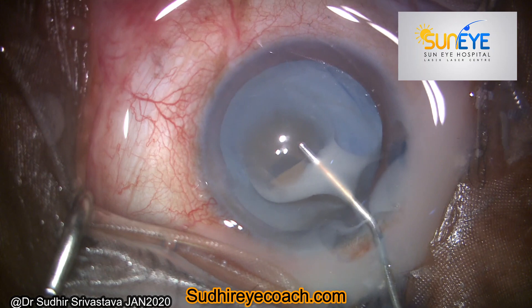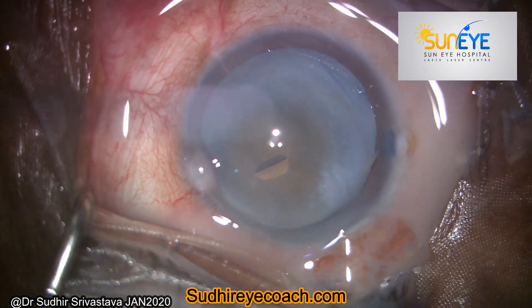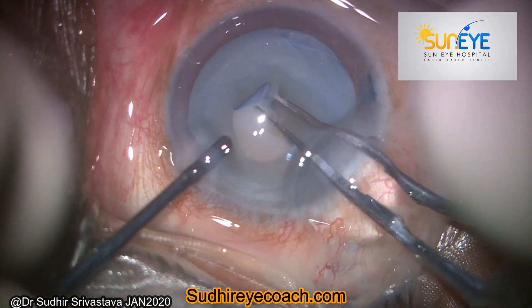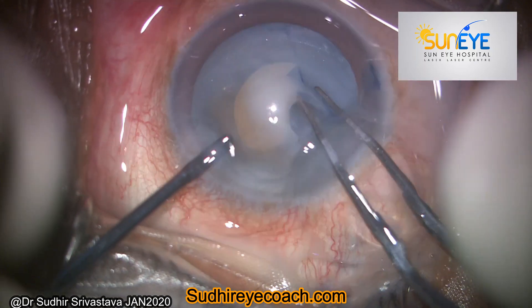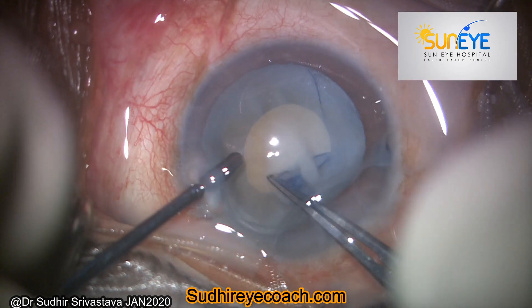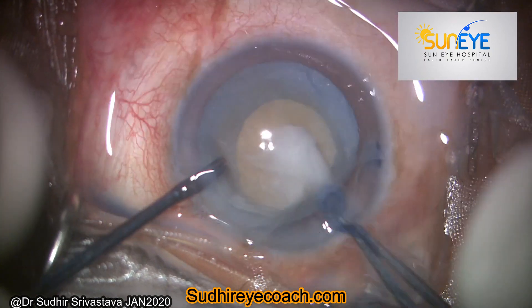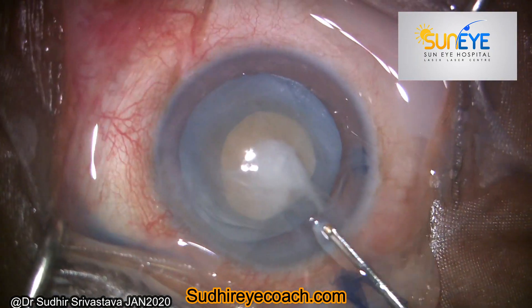As I made a small nick in the anterior capsule, you can see that milky fluid came out from the lens. This is the time where you can also assess the strength of the capsular bag.